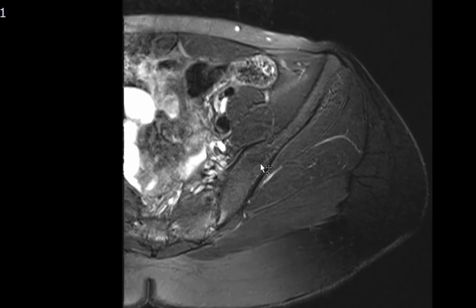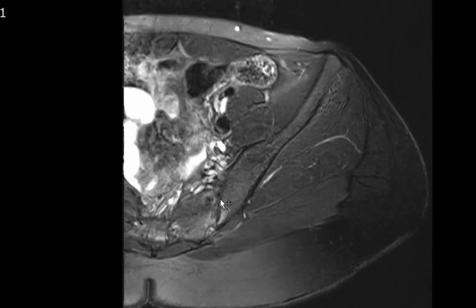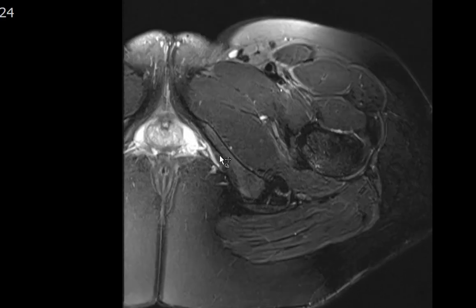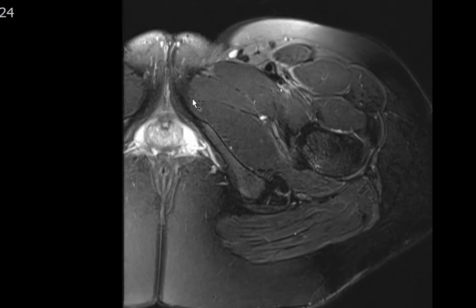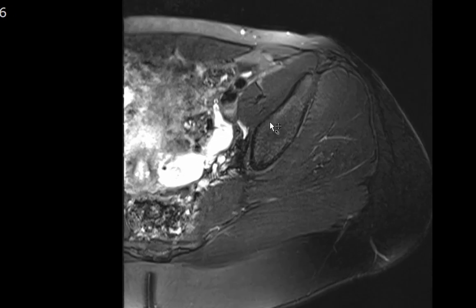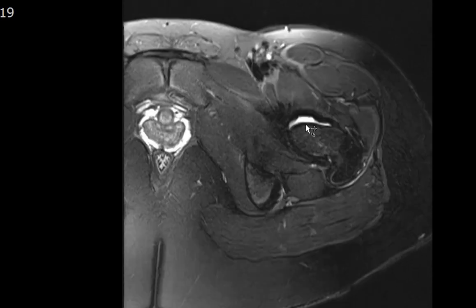There are no focal chondral defects. The sacroiliac joint is intact. The inferior pubic ramus, pubic symphysis, and superior pubic ramus all look intact with no joint effusion. Looking at the muscles, we check for T2 hyperintense signal suggesting muscular contusion or strain — a strain results from eccentric muscular contraction during exercise, while a contusion occurs in the setting of trauma.